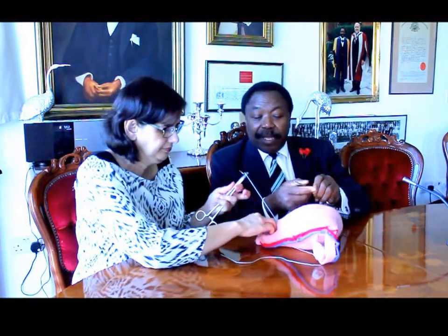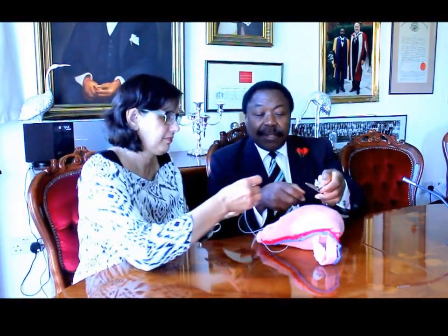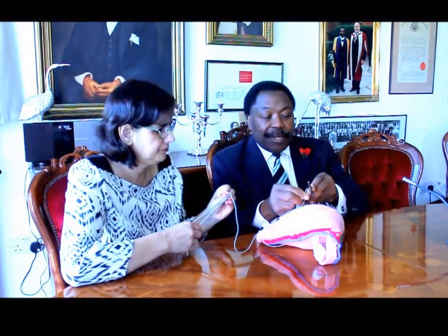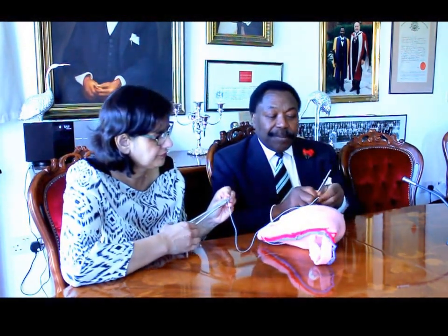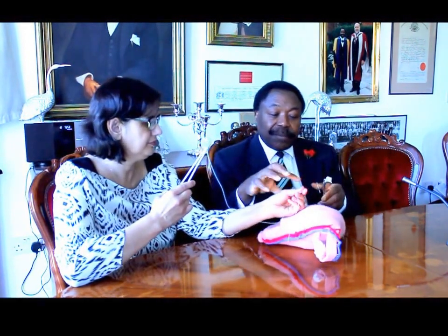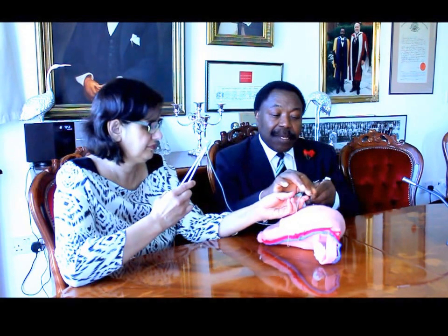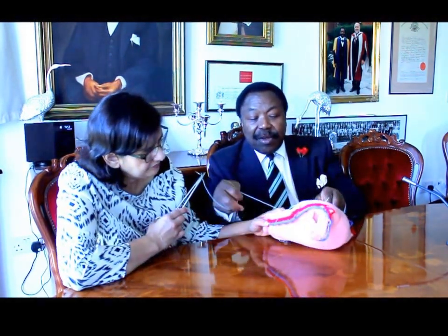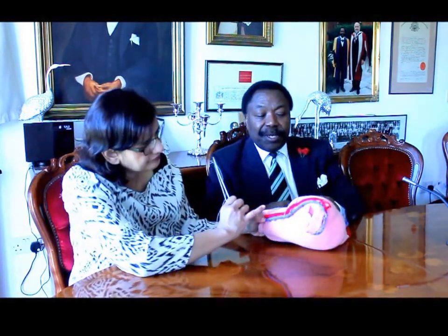The other limb of the suture is put on a clip so we do not lose the tension on it. Dr. Javid, give yourself enough length of suture to continue the procedure.